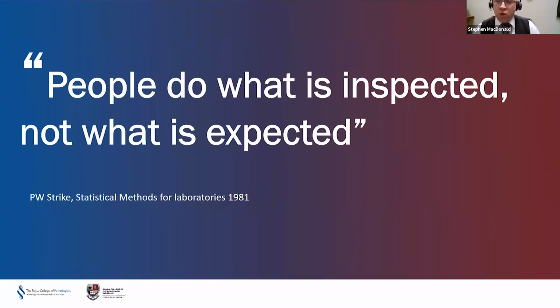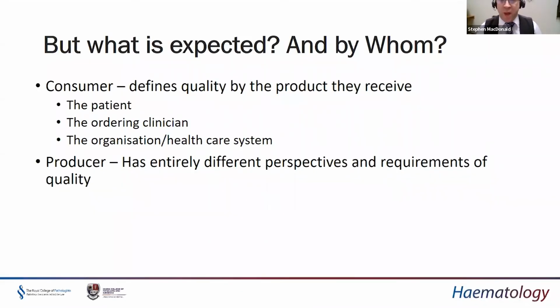Are we doing what is expected for a quality service, or are we doing something just to tick boxes to try and get through assessment schemes? But the problem with that is we need to ask the question, what is expected? And probably more importantly, who is making those expectations? Is it us in the laboratory? Is it people outside the laboratory who we're providing the service for?